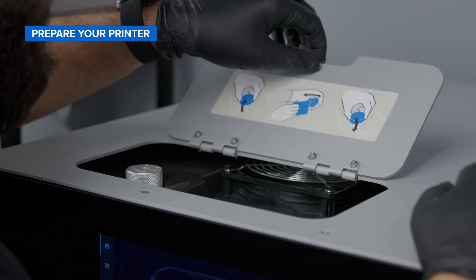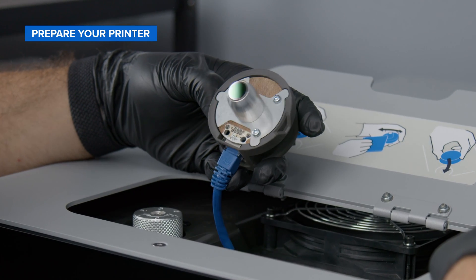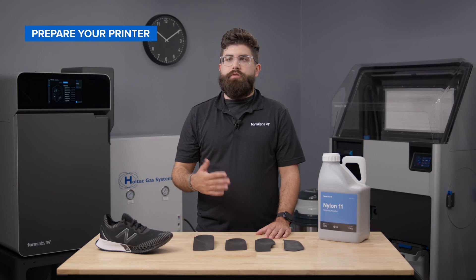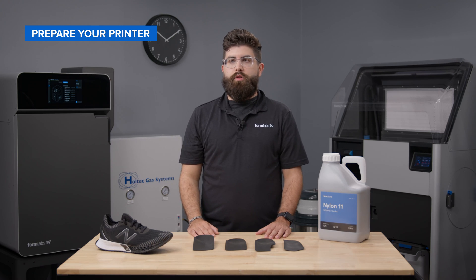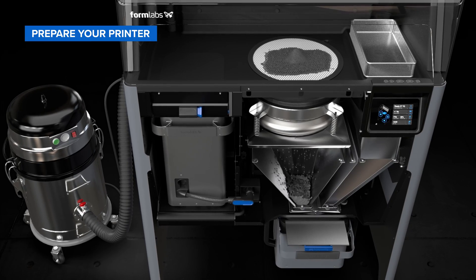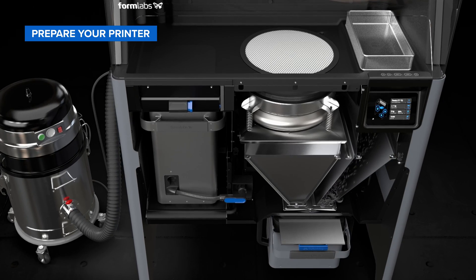Lift the IR sensor access door on the top of the printer and inspect the IR sensor, cleaning if necessary. Ensure that all of the access doors in the printer are closed. Now, prepare the nitrogen system. Nitrogen prevents the oxidation of Nylon 11 powder and maximizes consistency in quality and cost effectiveness at a refresh rate of 30%. This means you can reuse 70% recycled powder and only require 30% fresh material.